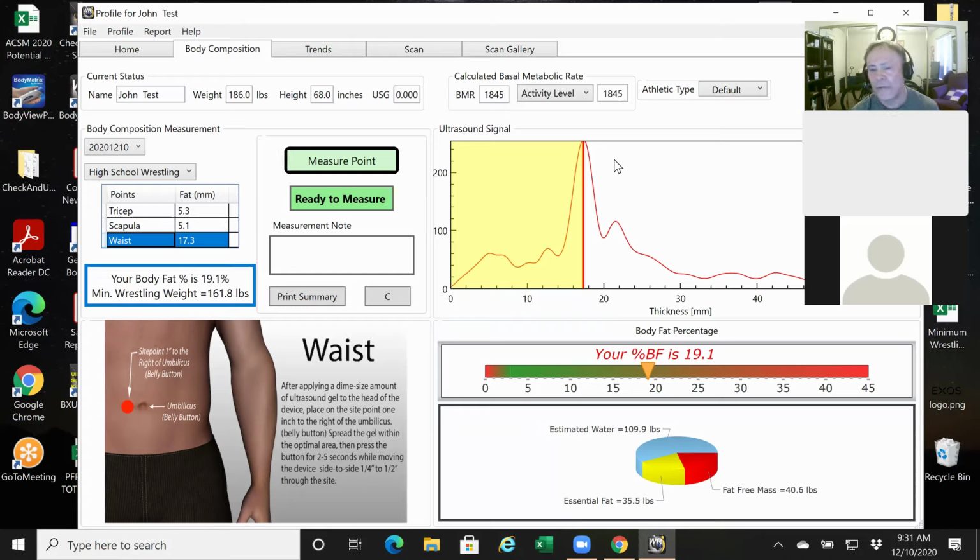I could, in theory, just exit out of this profile now and then open up a new one and start the next athlete. But I want to talk about a couple of different things I think are going to be really helpful for you moving forward.